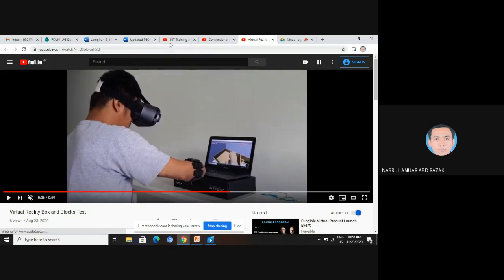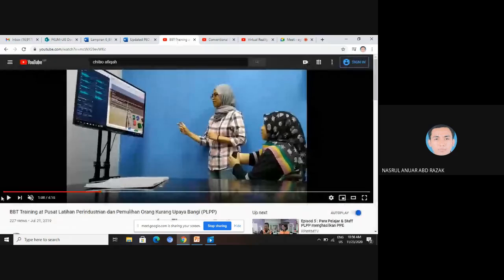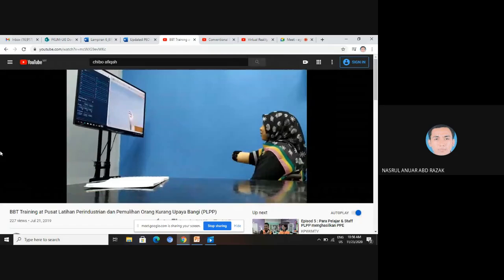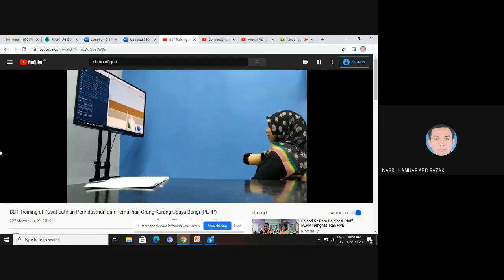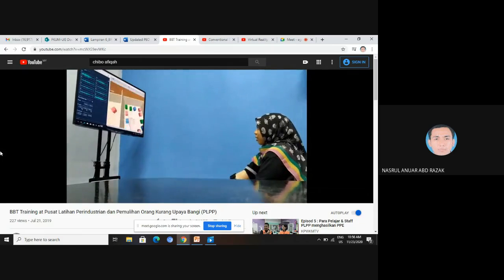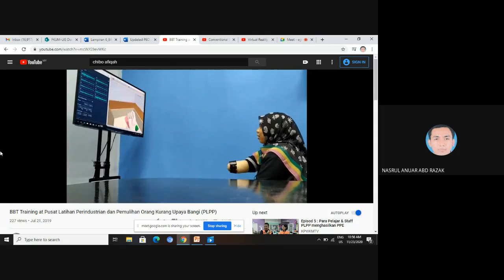Another video, and maybe this one. There you go. She can imagine that she is having a hand. So this will help improve communication with her muscles, and at the same time integrate when she is provided with the prosthetic later on. Okay, so this can help her build proper strong muscle, so that the prosthetists and orthotists know where to install the EMG sensor, etc.